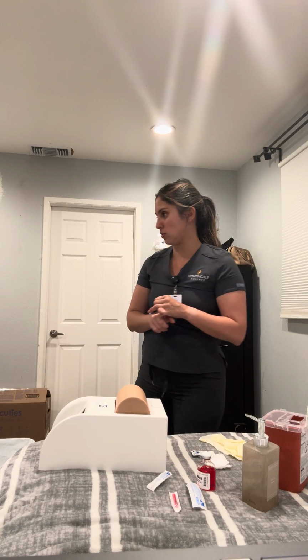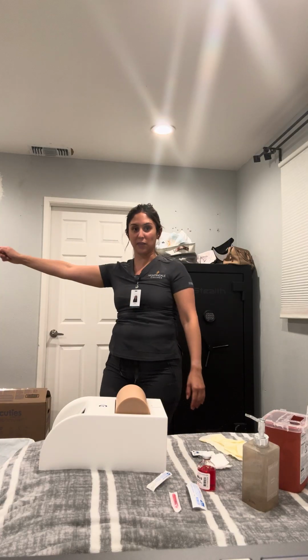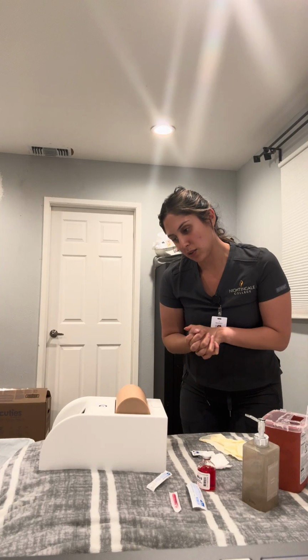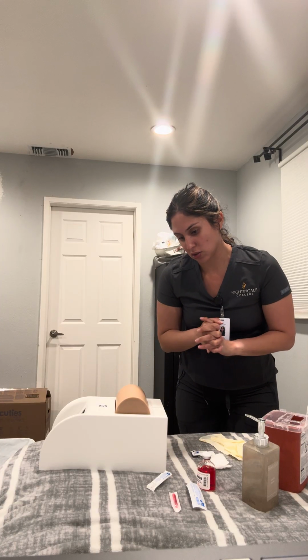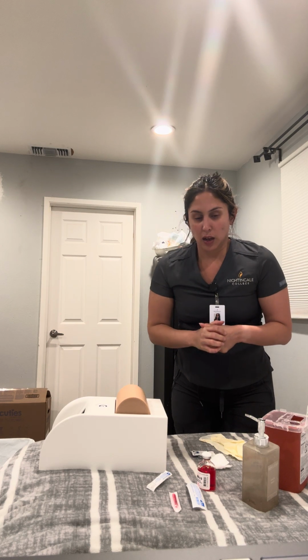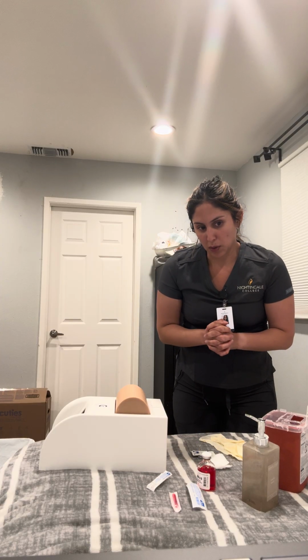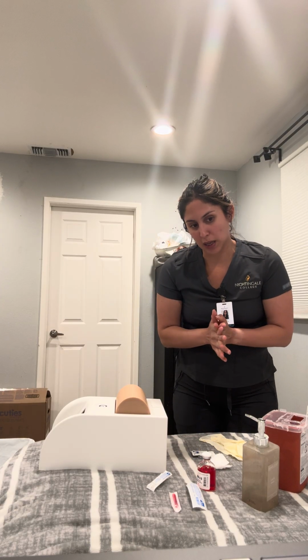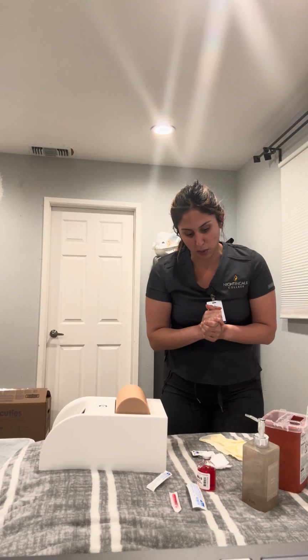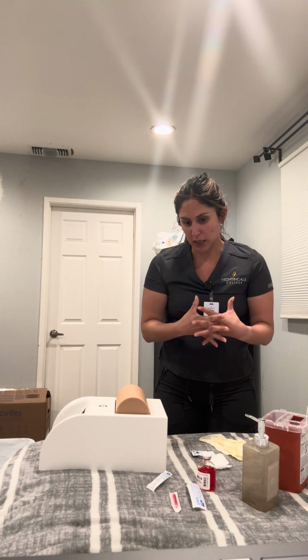Now we're going to go to the patient's room. I'm going to come into the room, provide for privacy, and perform hand hygiene. I'm going to introduce myself to the patient. Hi, my name is Yvette, and I'm going to be your nurse today. It looks like the doctor has ordered some pain medication for you, morphine. Morphine is going to help reduce the receptors of pain in your body. This procedure is going to take a couple of minutes.